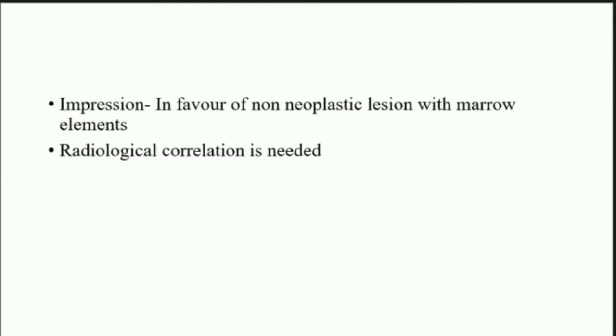Impression we made is in favor of non-neoplastic lesion with marrow elements. We can consider it as a chondromyxoid fibroma, but we need radiological correlation for the definitive diagnosis. Thank you.